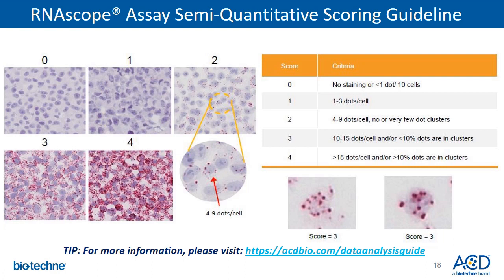With the semi-quantitative approach, you may manually count the number of dots per cell and score the sample from 0 to 4 based on the scoring guidelines. For example, if you see 4 to 9 dots per cell with no or very few clusters, that is a score of 2, which is what we would like to see with positive control POLR2A staining on most samples during sample QC. If the staining shows more than 15 dots per cell and 10% of the dots are in clusters, you would score the sample as 4.